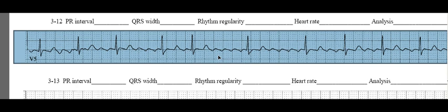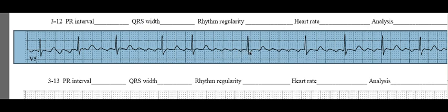I've got two of them here and three of them over here. Way too many to be P waves — too wide to be P waves. Maybe they're flutter. Let's look at our regularity: the QRS complexes are kind of randomly placed, but my little bumps here seem to be fairly regular. I'm kind of lost under the T wave, but pretty regular. I'm going to take a stab at the fact that this might be flutter.